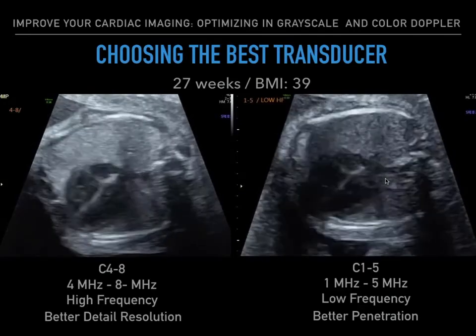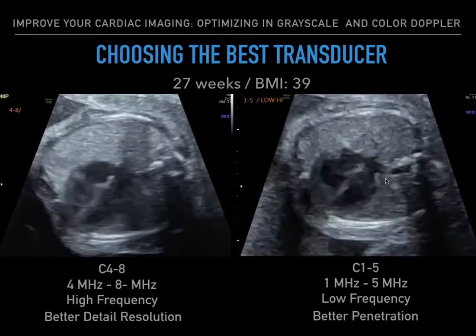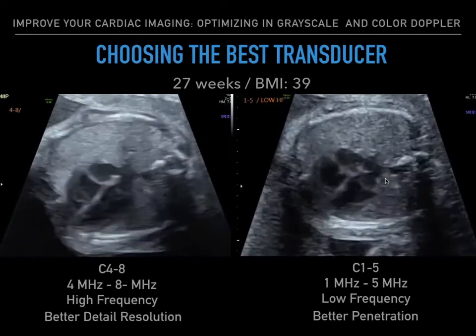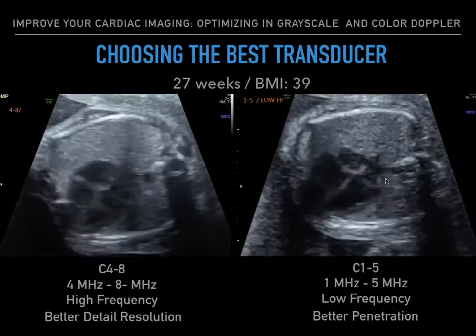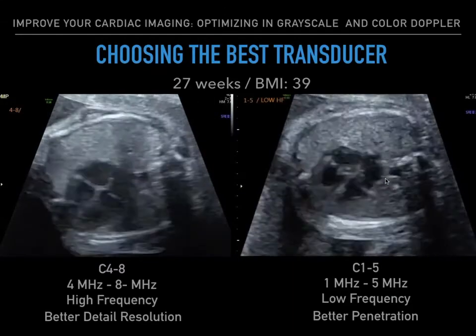The C1 to 5 low-frequency transducer provides better penetration, as we can see a crisper view of the heart, yet resolution is slightly decreased, giving it a slightly grainy appearance. So again, it clearly depends what you are aiming for: better resolution or better penetration.